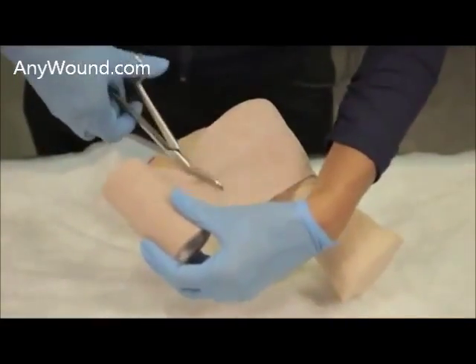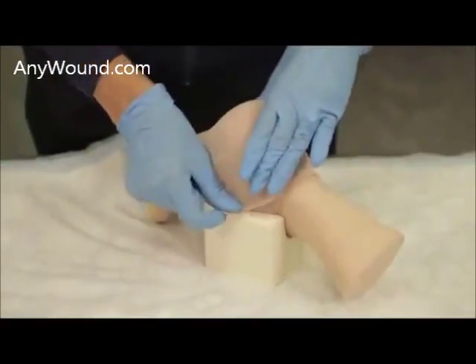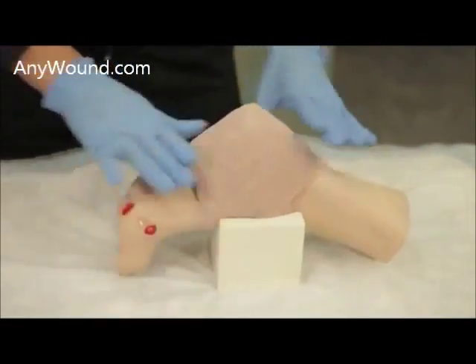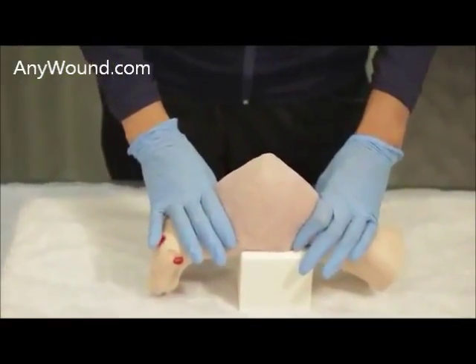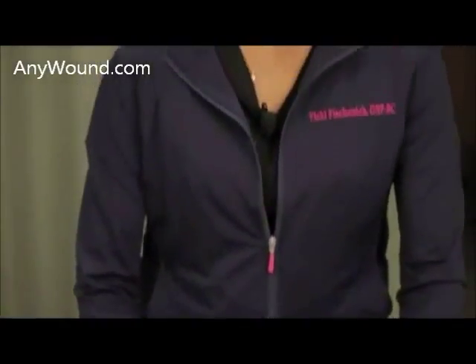We will cut the remainder of this, securing the dressing in all areas. So this is the application — a simple application, three steps: cleanse the wound, apply the dressing, secure the dressing.